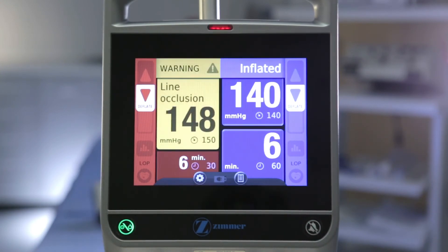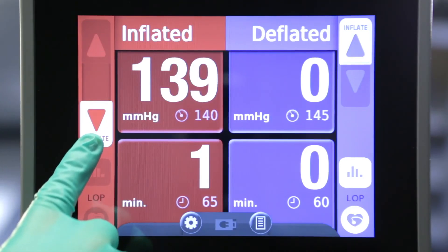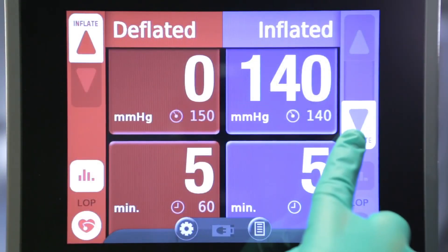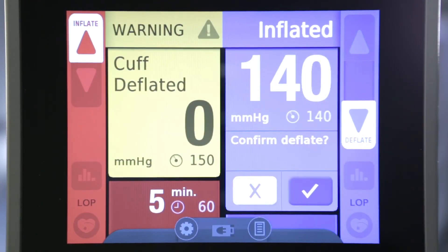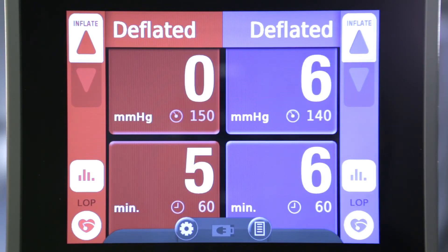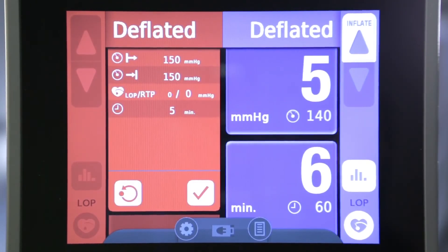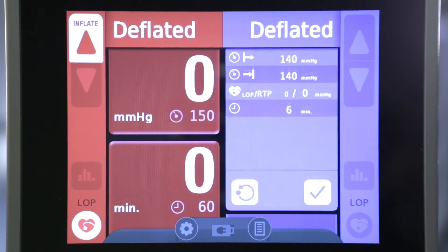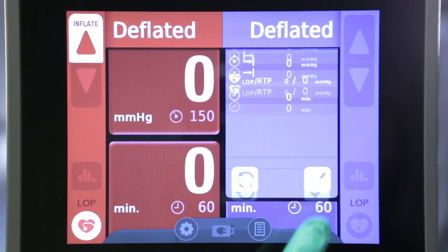For a major error, such as a line occlusion, the indicator light will flash red and a message will appear on the screen. This alarm cannot be silenced until the issue is resolved. To deflate the cuff at the end of a procedure, drag and hold the deflate button for 3 seconds. If the second cuff was inflated, you must always confirm deflation. Once the cuff has been deflated, a statistics icon will illuminate. Tap this icon to see starting pressure, ending pressure, LOP, and time the tourniquet was inflated. Tap the reset button to zero out the statistics. The statistics must either be reset through this process or through restarting the machine before the next procedure.